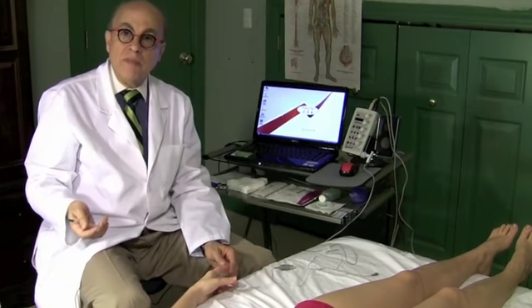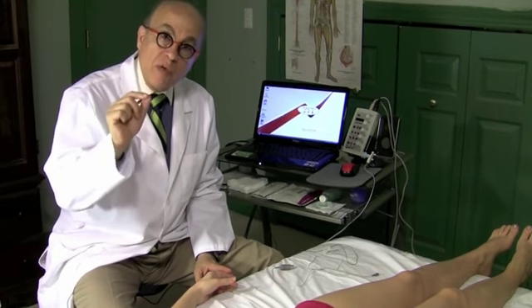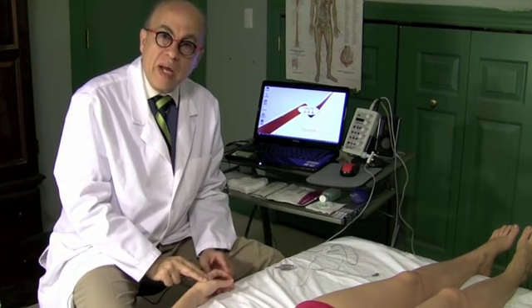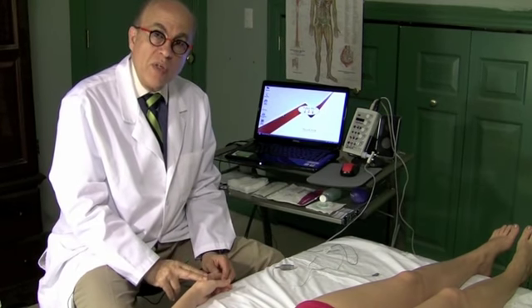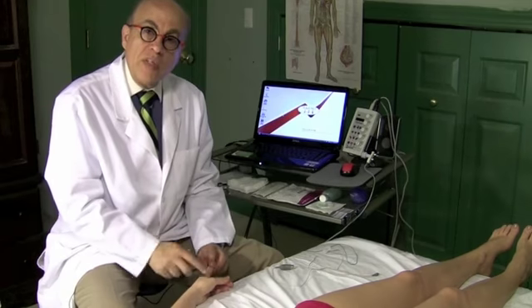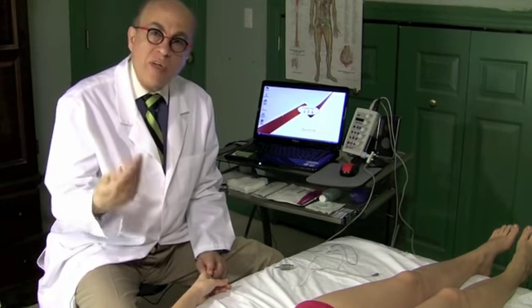So we study the muscle during activation at 3 levels, mild effort. And I will show you that with mild effort, you only see few motor units, therefore you can study them very nicely. We study them at moderate effort. That means you study the muscle when it's more activated at maybe 30 or 40% activation. You still can see independent motor units, individual motor units, but you can't analyze them as nicely and easily. And then we want to see if all the motor units can get recruited when the subject puts full strength. And now we ask the subject to put as full of an effort as possible just to see if they have enough motor units or not.